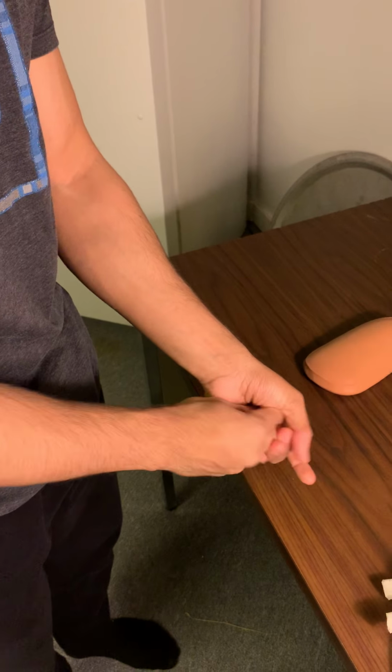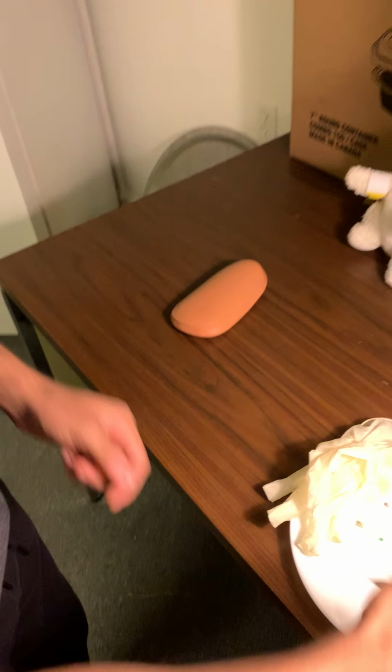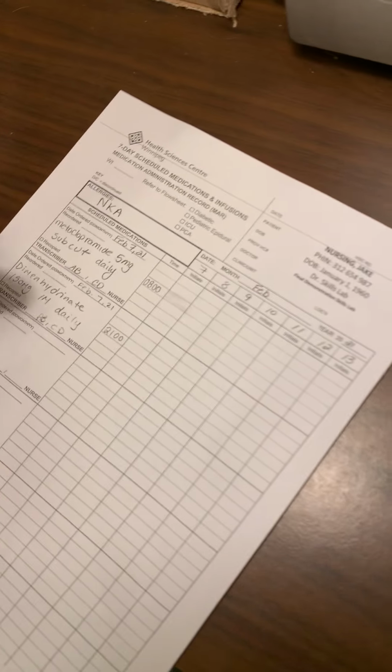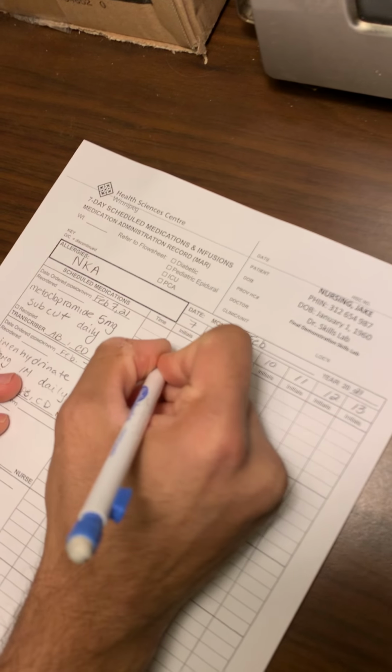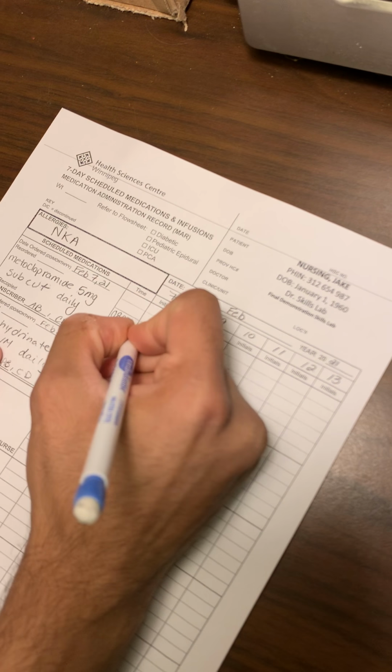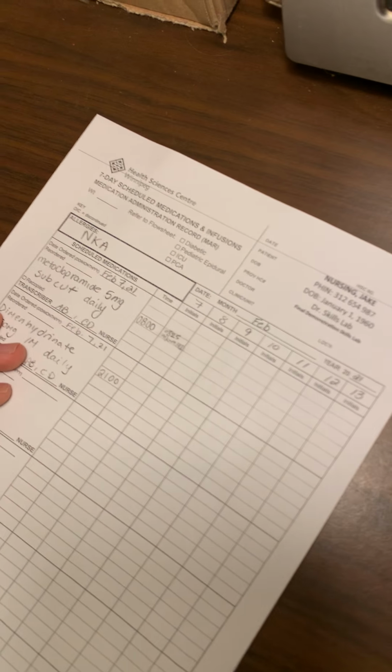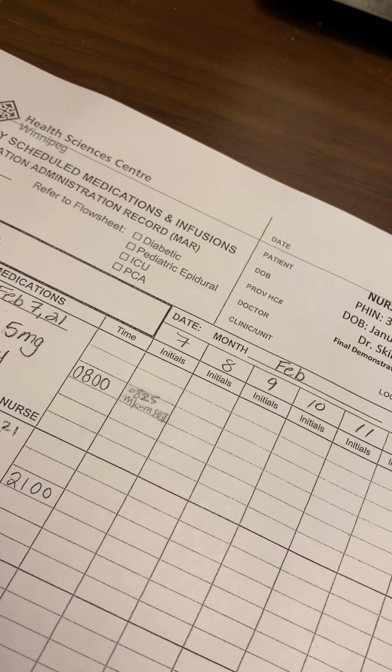Okay, once I've done that, I can just do hand hygiene. Now I can sign the MAR. And again, in a clinical setting, I would be signing the MAR with a black pen. But for demo purposes, I'm not going to be doing that. Okay, I've given that medication.